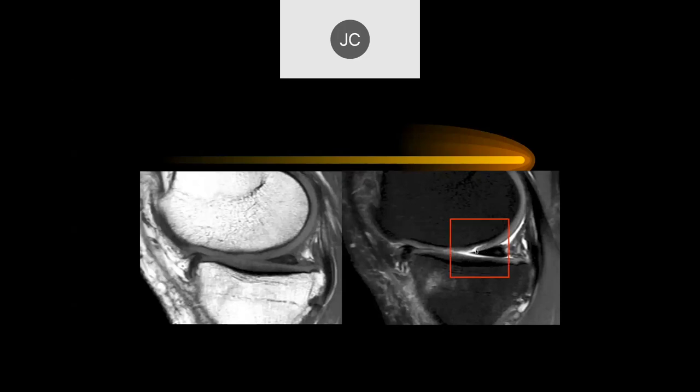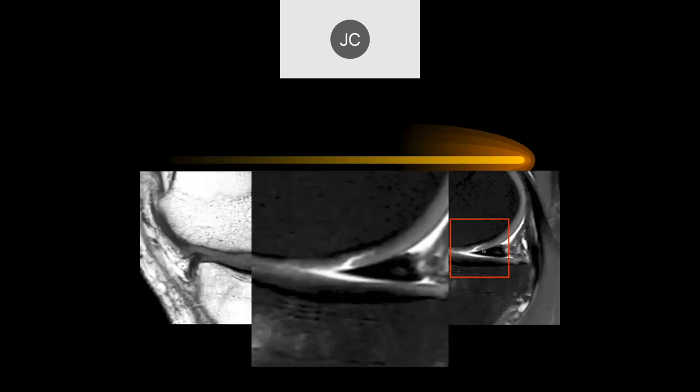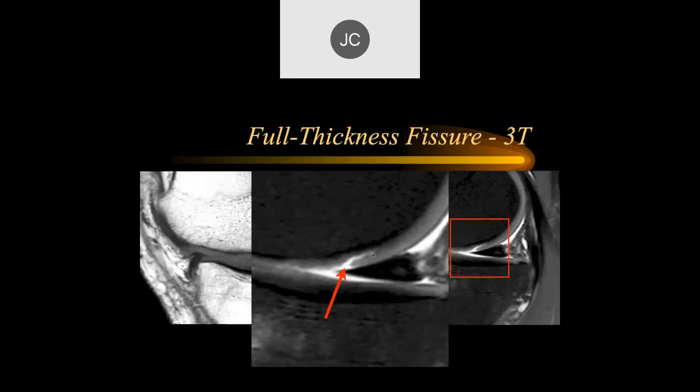If you try to measure this, you have to measure from there all the way over to there, because presumably if they're going to do a graft, they'll need to remove the unstable part. As John was saying, in a kid they might want to preserve it, but in adults that doesn't work very well — you usually have to remove the unstable fragment.